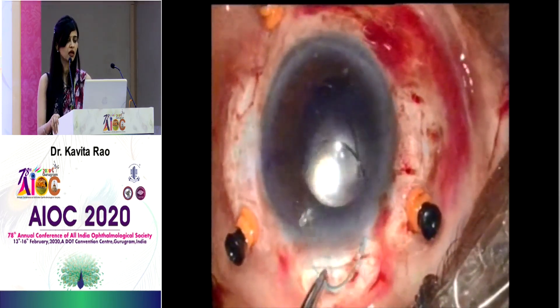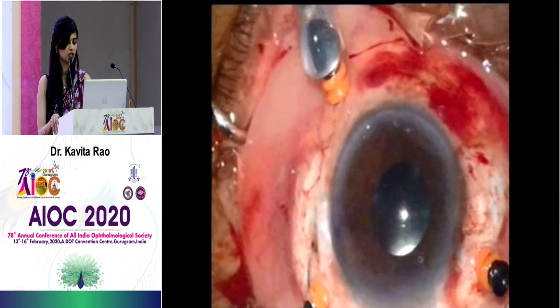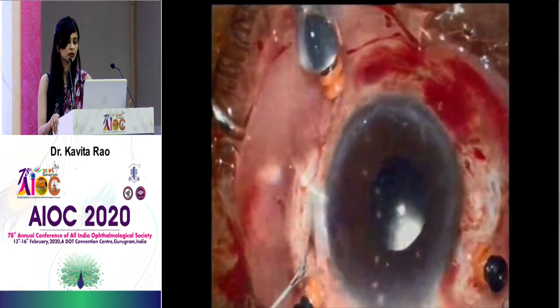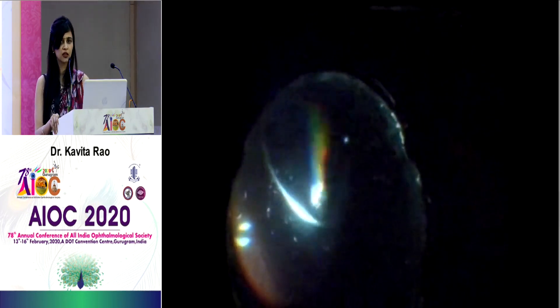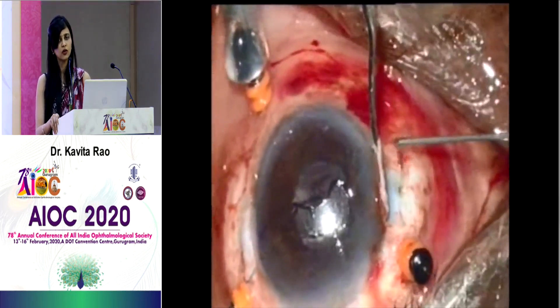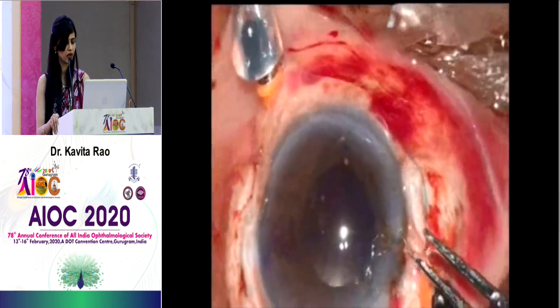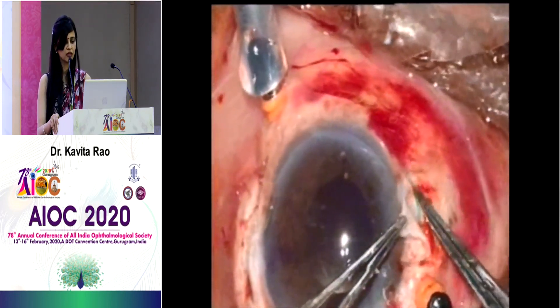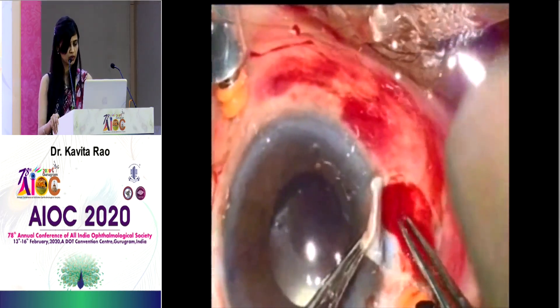This is the handshake technique, where we grasp the haptic and pull it out from either end. I prefer this over the Yamane technique because I feel there is a lot of IOL decentration with Yamane's technique, based on what I've seen in the literature and in other surgeons' cases.